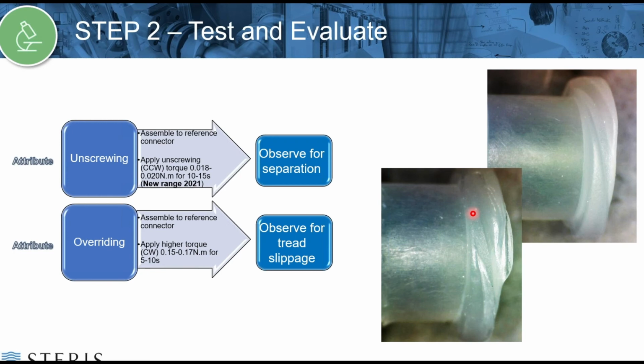We often get asked by our customers, do we need to perform the pressure test both after stress cracking and in isolation in a separate test? And we have confirmed with the ISO committee that yes, you do need to perform both tests. Again, this is a variable test.